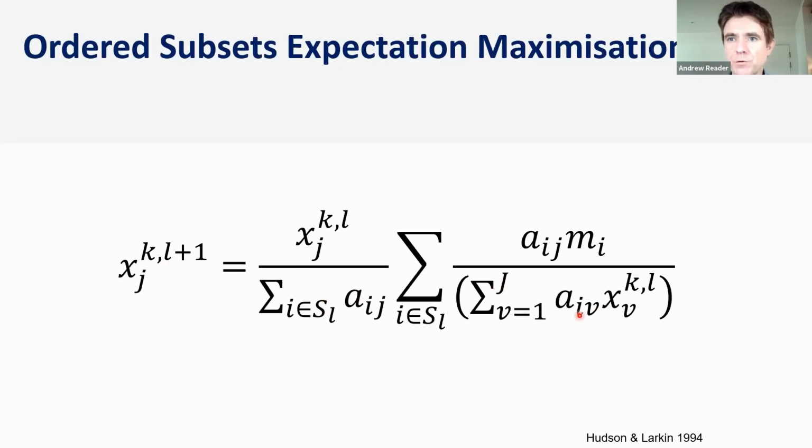And so that means whilst this forward projection looks like it's doing a full forward model, I should have a subset index here. In reality, you only need to forward project, of course, into the subset that you're about to back project. There's no point forward projecting into data that won't be used. And so in other words, if you use 10 subsets, 16 subsets or whatever, that's an order of magnitude less work to do a forward projection and a back projection, and you've already got a multiplicative update.